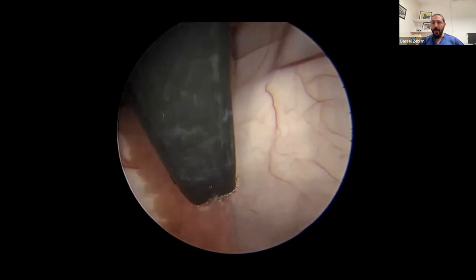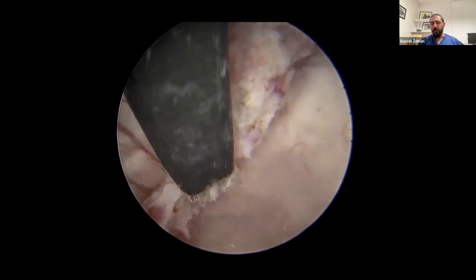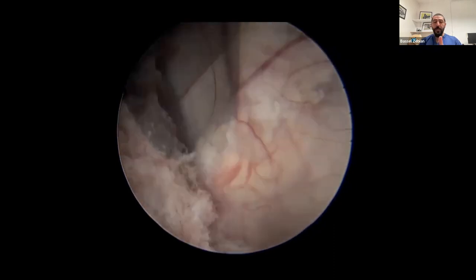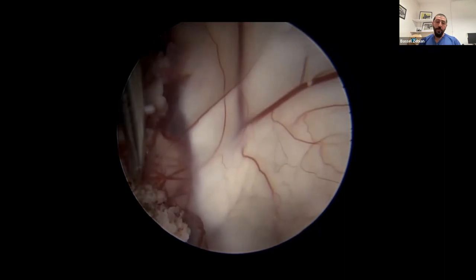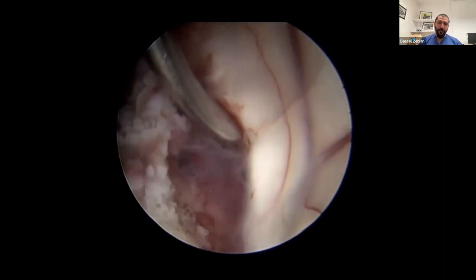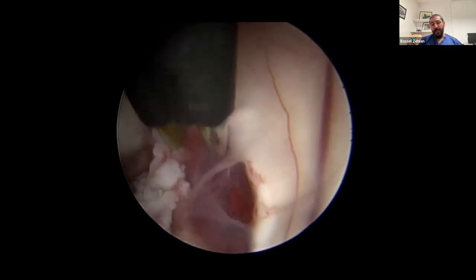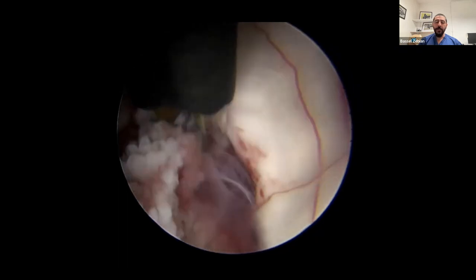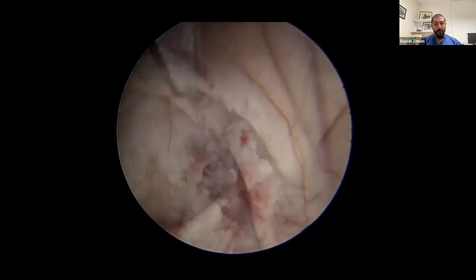It's always further back where the internal capsule is that you'll get normally leg or foot or something along those lines. So you can see here the choroid plexus being coagulated, pushed out of the way, and these are the taeniae fornices. On the other side, of course, it's the taenia thalami, and you just put a dissector. It has to be the broad dissector, so it's easier with the InVent rather than the MINOP intraventricular. You are buzzing quite close to the fornix. We've not had major trouble with that.